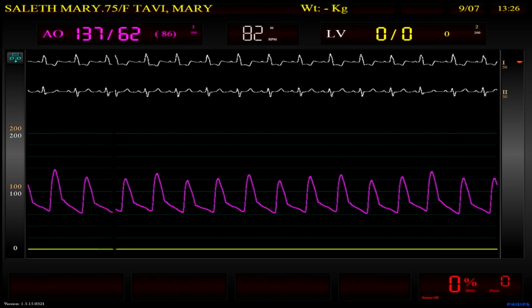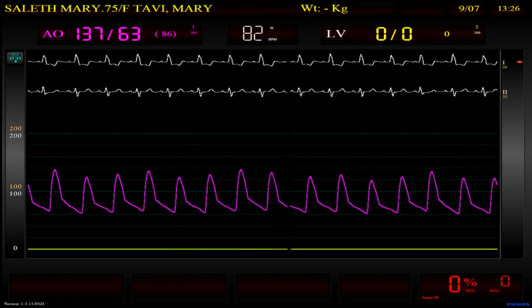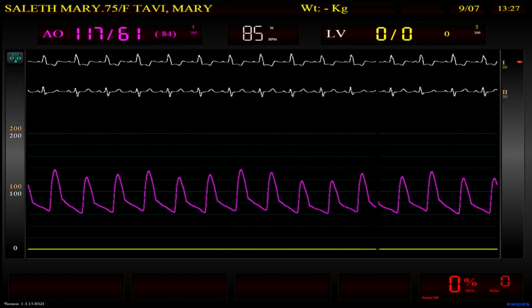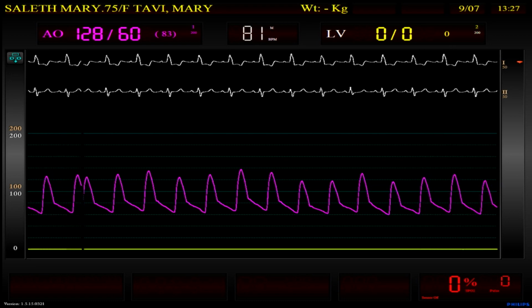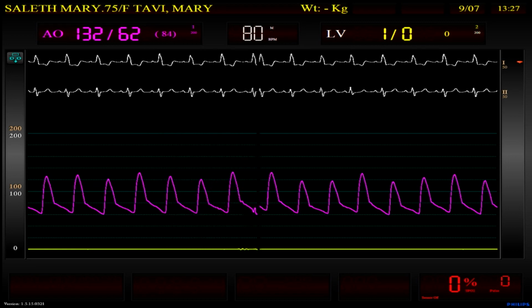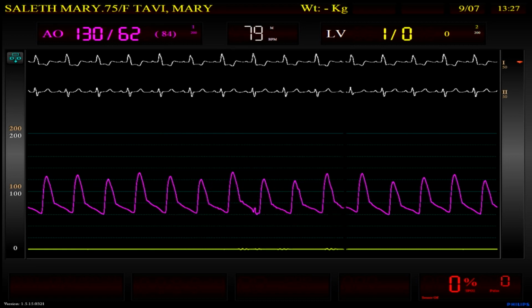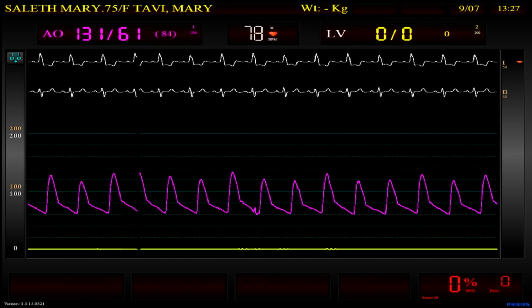But in this patient, I think leaving the lead for 24 hours is reasonable. Yeah, for a few hours is reasonable. In our setting, it's quite reasonable. So be safe. What I generally do in this setting is to remove the pacemaker. My own practice also would be to remove the temporary wire, but I think as Ashok is saying, you need to be cautious and you need to put safety first. That's a very, very important point.